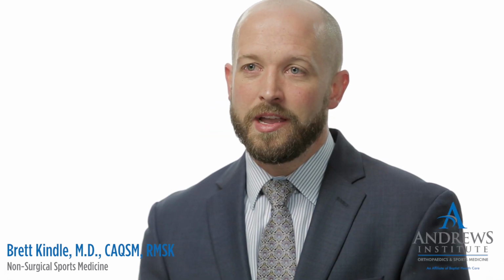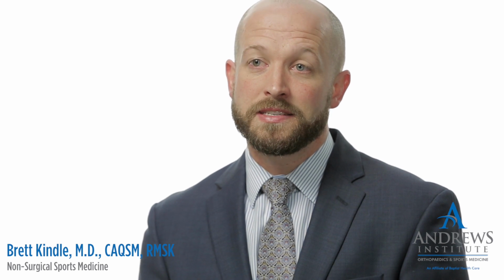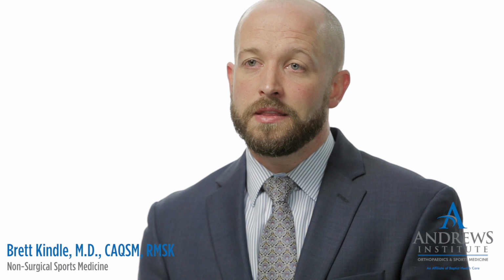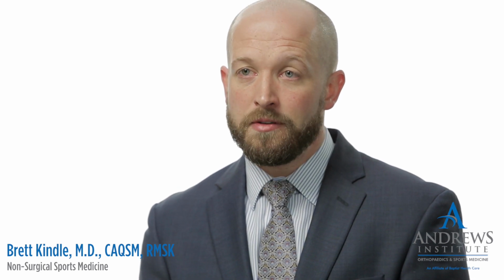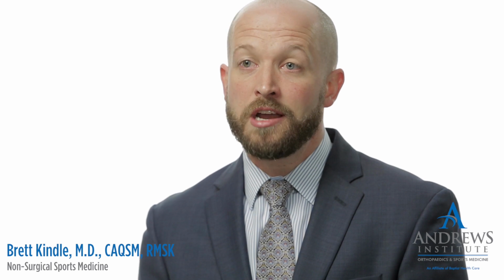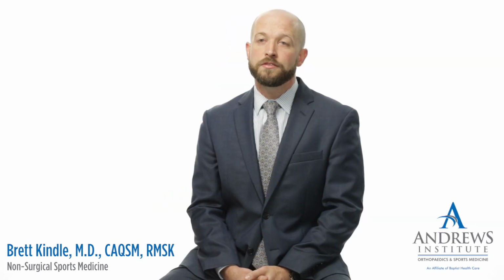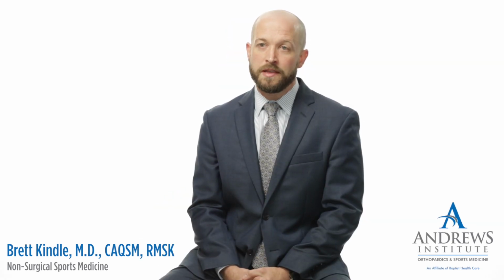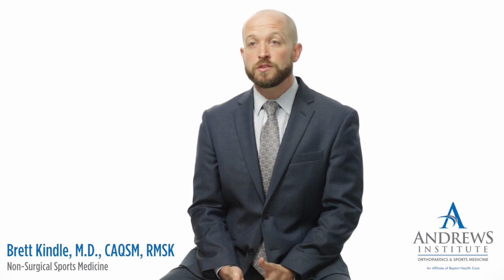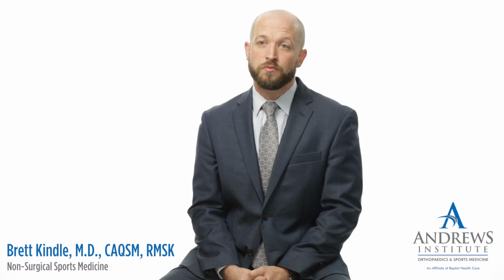Another great advantage of MSK ultrasound is that it is exponentially cheaper than most other imaging modalities. This oftentimes is able to save a patient from getting a more expensive imaging test that may not be necessary. However, I do think it is very important to understand that other imaging modalities certainly serve a role, and we oftentimes will obtain MRI and/or CT scan prior to a surgical intervention if that's warranted based off the diagnosis with the ultrasound.